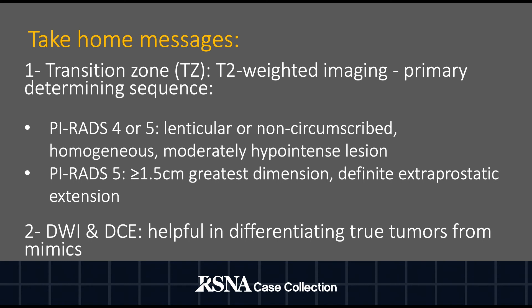When a lesion like this is 1.5 centimeters or larger, or shows definite extra-prostatic extension or invasive behavior, then it belongs in the PIRADS V category. Both the dynamic contrast and DWI sequences can help draw your attention to pathology that you can then further define on T2 weighted images, and these sequences are also helpful in differentiating true tumors from pathology mimics.